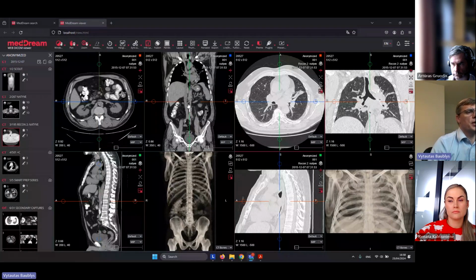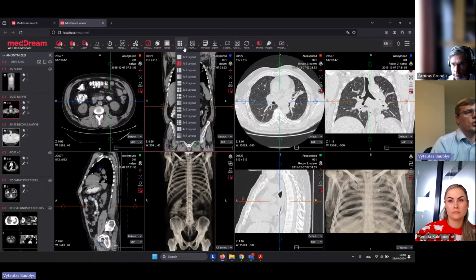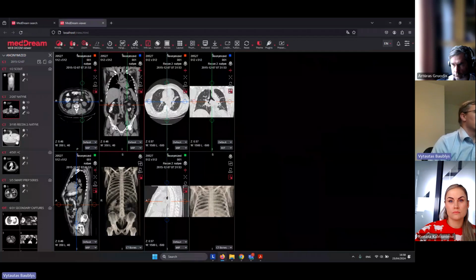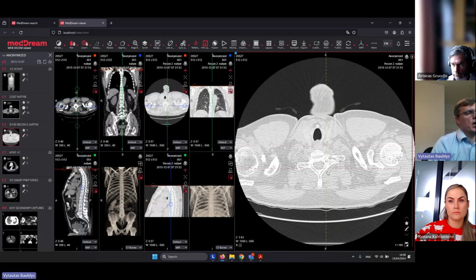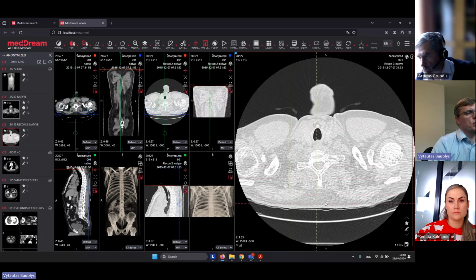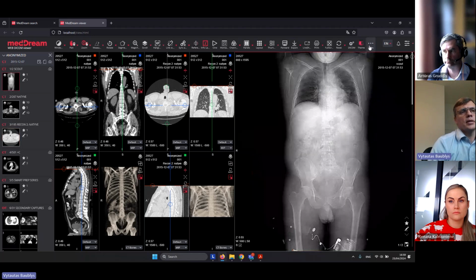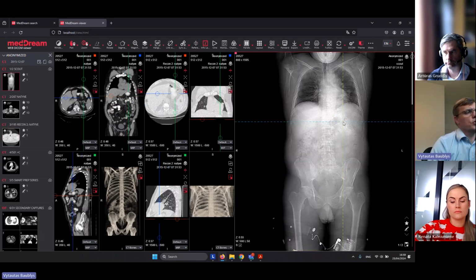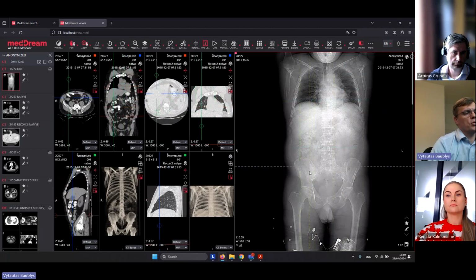As you see now, I'm not able to use the crosshair across them because I'm moving only one selection. But if I change the layout to, for example, three images, and I put one extra image from here, and I use the crosshair here, now it's propagated between all three views. So if I drop like this and select the crosshair layout, now I can scroll through the whole body, reaching exact points on the MPR view.